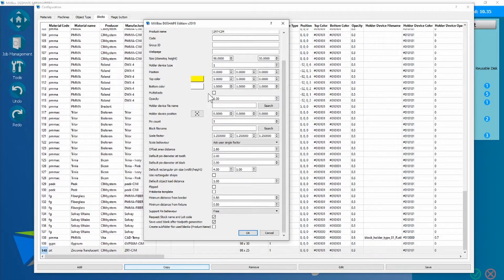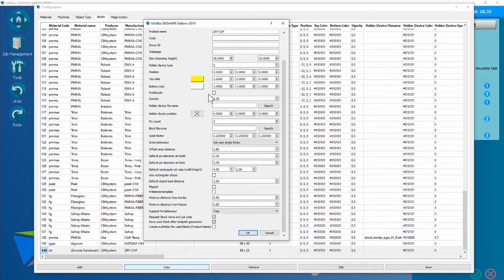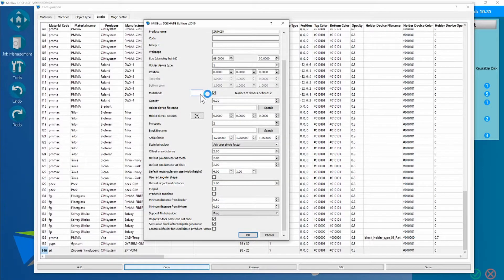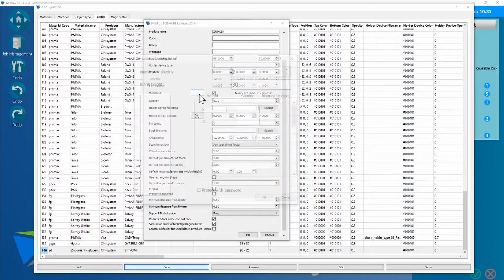However, if you wanted to go one step further though, you could check the box multi-shaded, and here again, create your own disk.